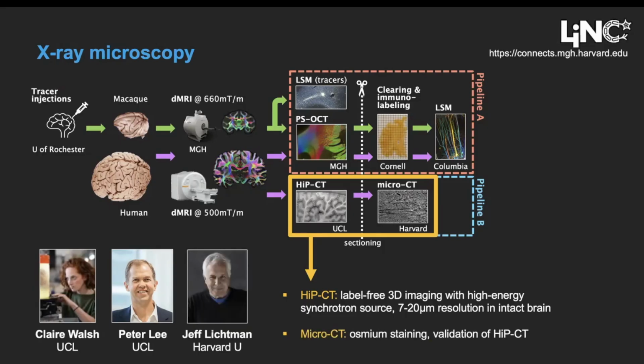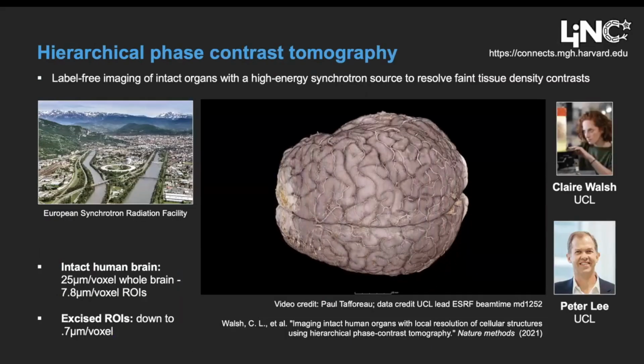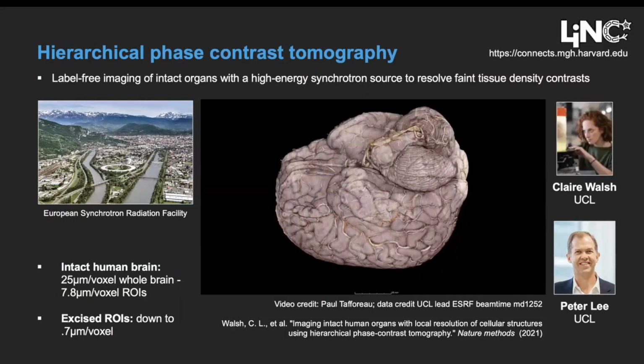And this will be validated against conventional micro-CT of osmium-stained sections in small areas within the brain to validate the more novel HiP-CT contrast. So again, I don't know if you've been counting, this is about 5 different modalities that we'll have to put together. This is an example from previous work by Claire and Peter.